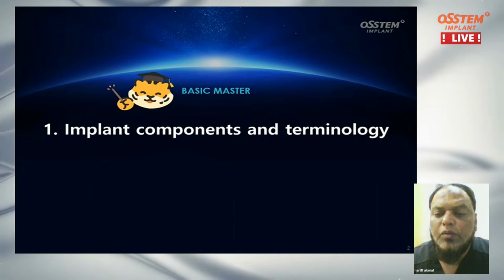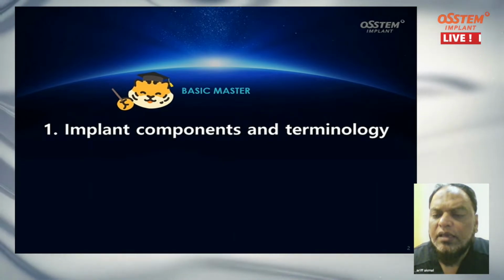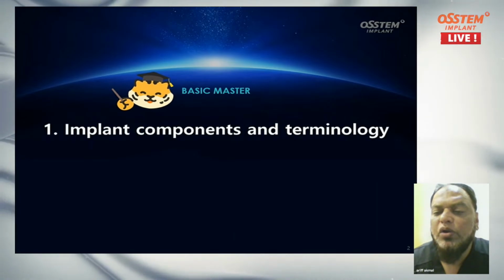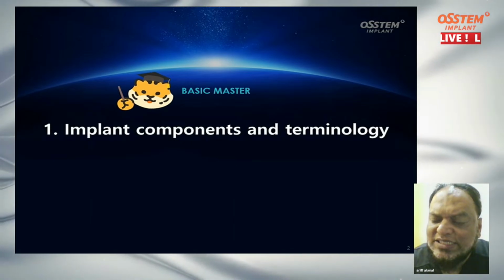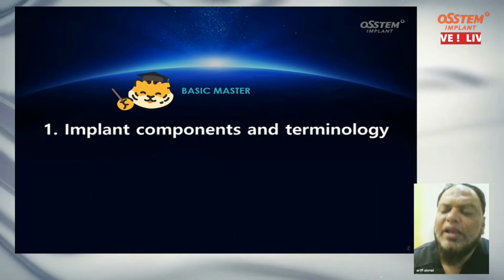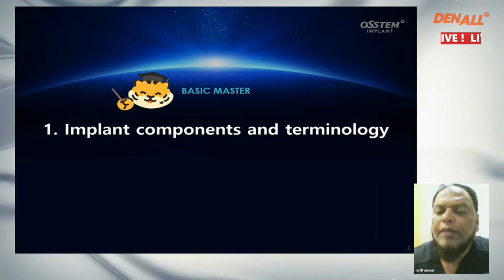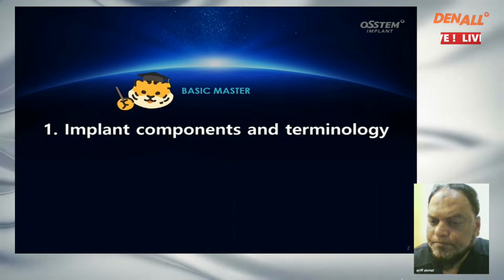Your first step in full mouth rehabilitation will be preparation of this complete denture. Get the bite, get the occlusion at the right place, and then using that as a template, you will be going for the fixed implant process. So knowing the basics is very, very important. If you are not knowing how to prepare a CD with the best of the occlusion, you will be landing into problems when you start doing the full mouth rehabilitation with the implants. So knowing the basics is very, very important.